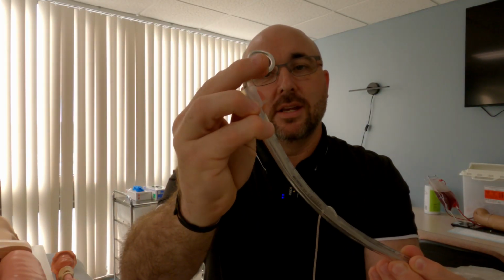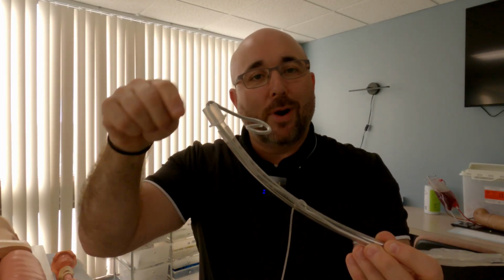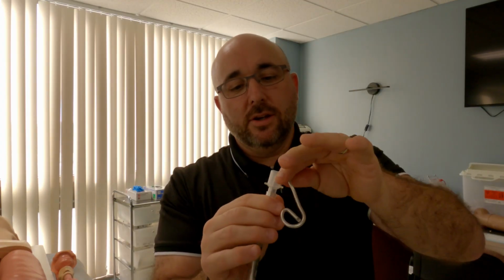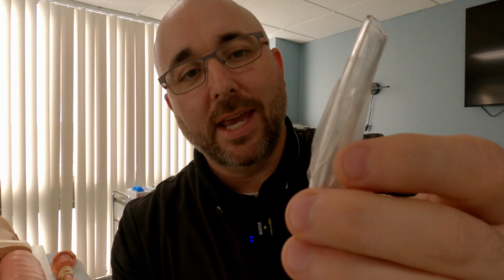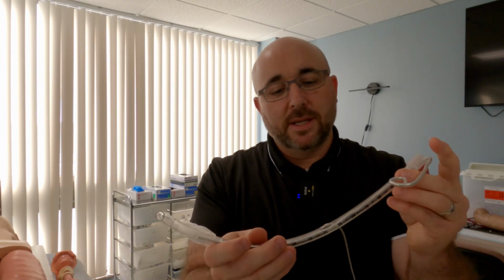You take this and you just bend this over like that. Now don't bend it and wrap it and whatnot, because you're going to have to withdraw this. But now you see at that point, it's no longer sticking out. And if you can't see, it's about mid-cuff level. So mid-cuff level is a good place to be for that.